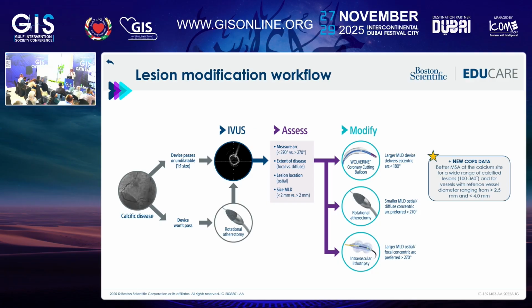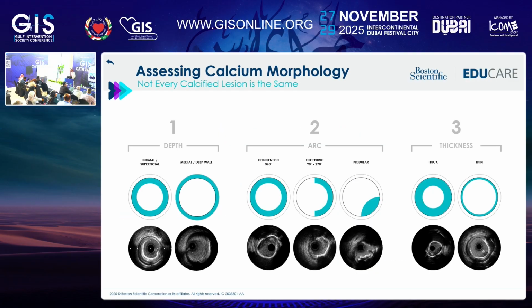So the message here is you use the platform to decide what you are comfortable with to debulk. What is more important once you debulk is to look at what strategy you used and what it translates into at the IVUS.